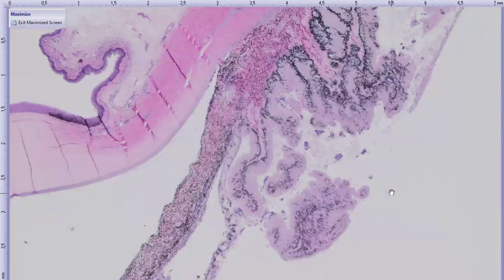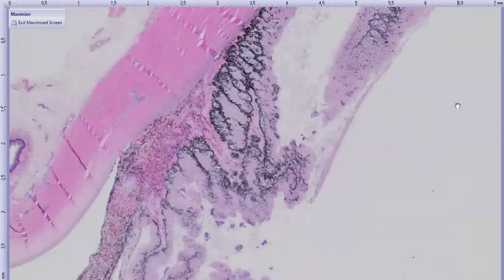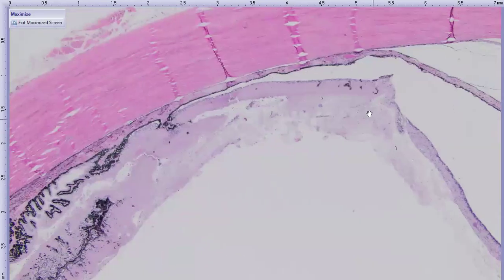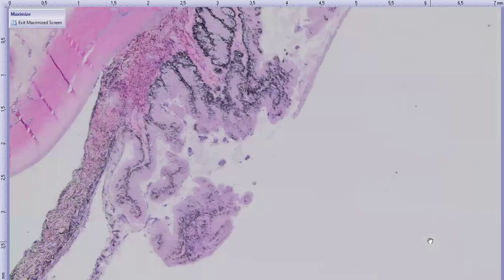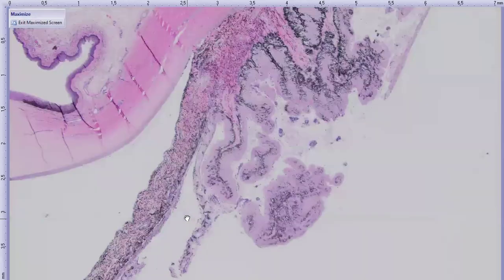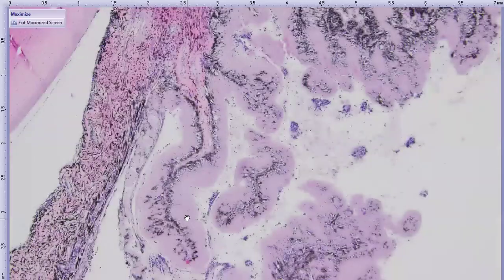And then as we go to the ciliary body surface, you can see that there's this pink stuff lining the ciliary body plicae. Sort of fuzzy pink stuff, pretty significant. And maybe a little bit of fluffy pink stuff extending into the vitreal space in the posterior chamber. And there's a little bit less of it along the posterior iris as well in this case, but mostly on the ciliary body surface. So let's take a look.